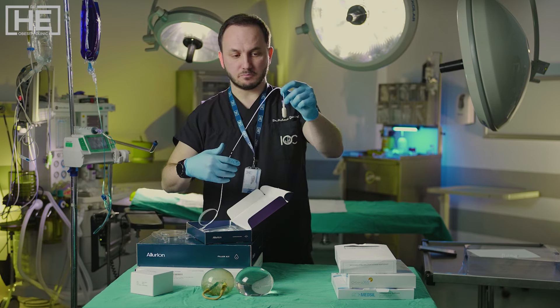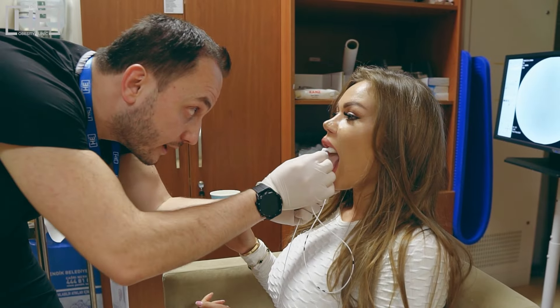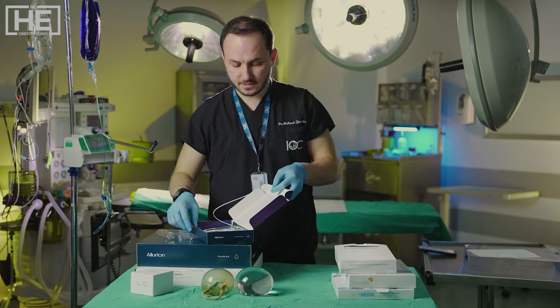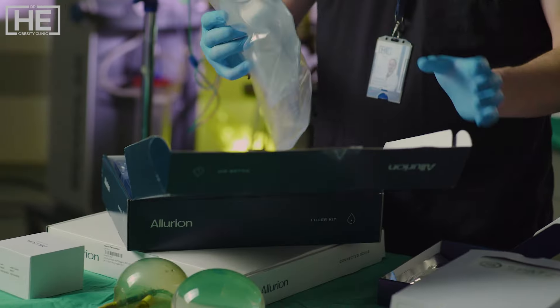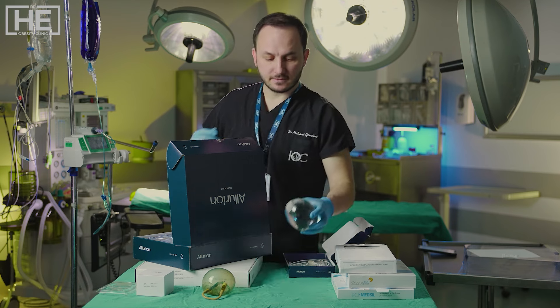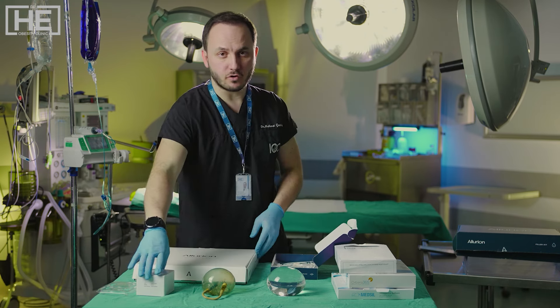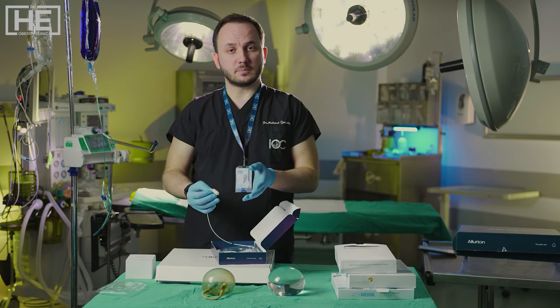This is our balloon. Look, this is a little tablet. We put it inside our mouth and start to drink. After confirming the correct position by x-ray, we fill it with 550 milliliters of saline. This filler bag goes inside our balloon.